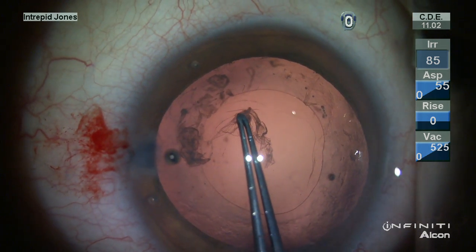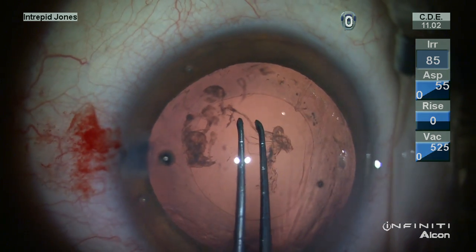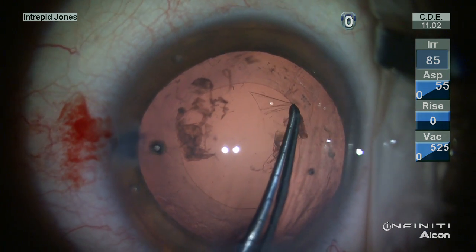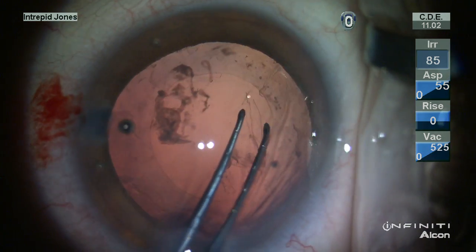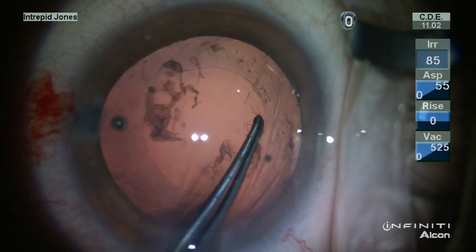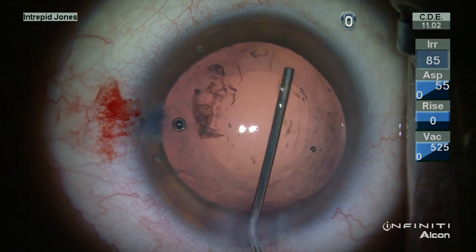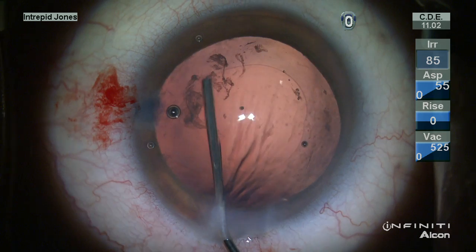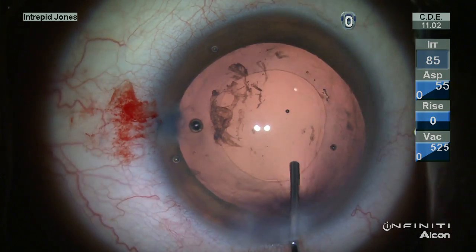Preferentially, one would polish the peripheral posterior capsule just inside the anterior capsulotomy in order to remove these fibrotic bands — these are indeed the reason why this is necessary. Once the capsulotomy is continuous and complete, additional cohesive viscoelastic inflates the capsular rim.